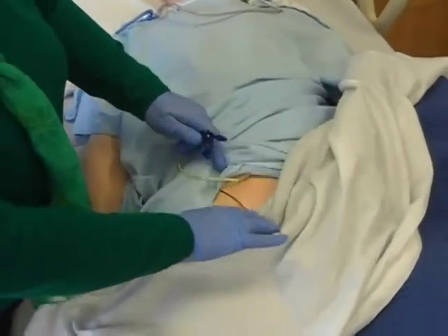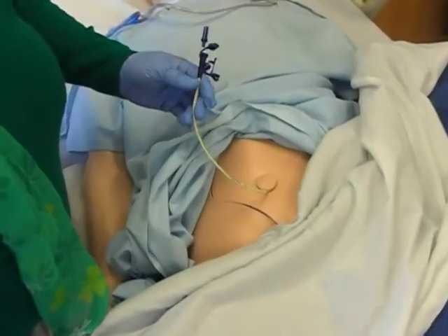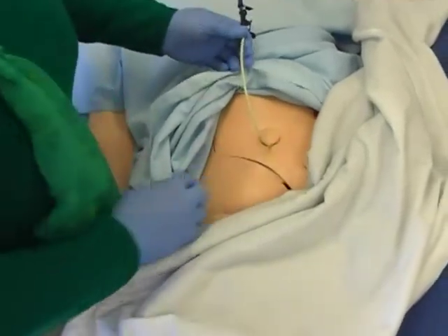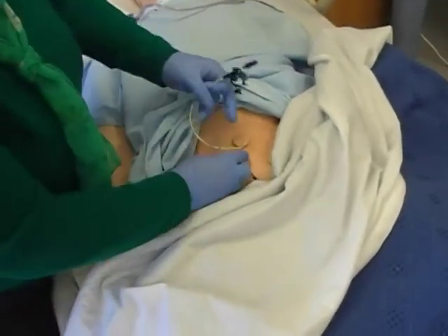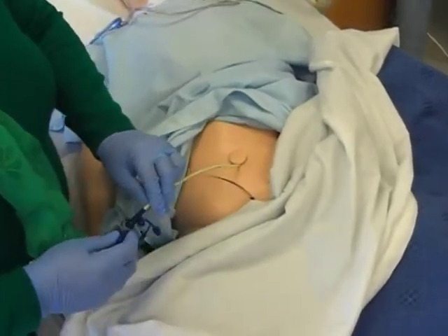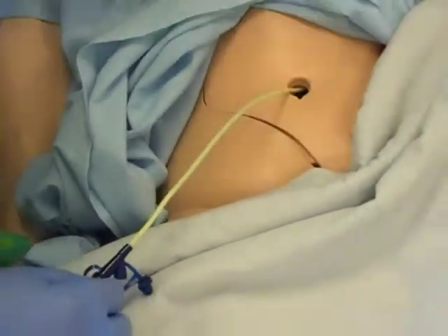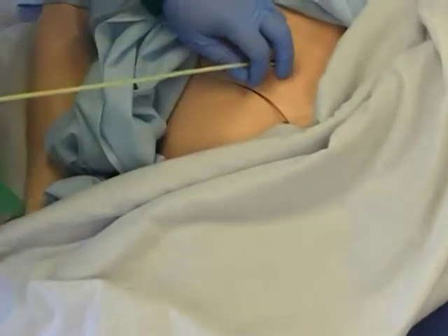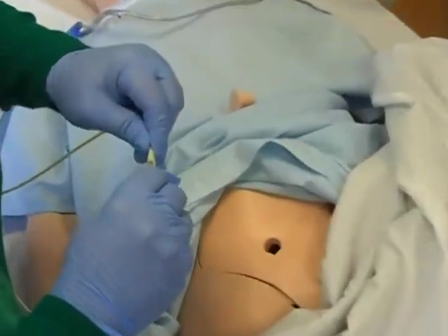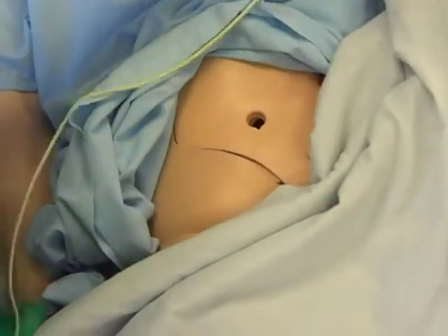Remember, this is a mannequin. On a real person, you're going to have a gauze over this, and it'll just be a tube. This tube is put in by the surgeon into a patient's stomach.